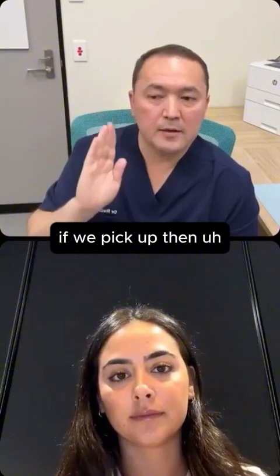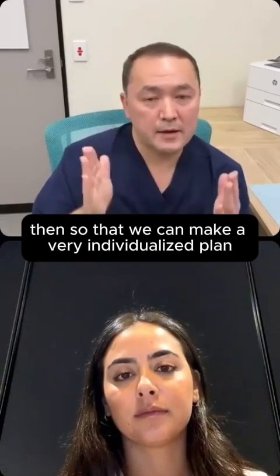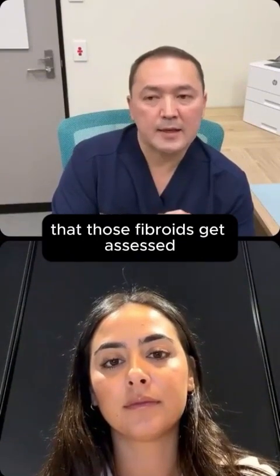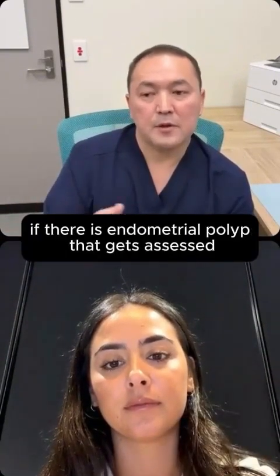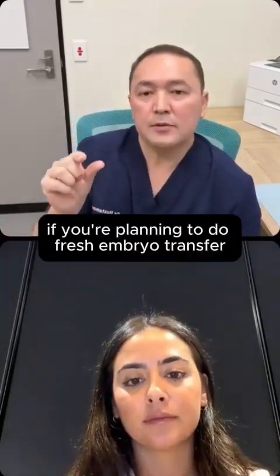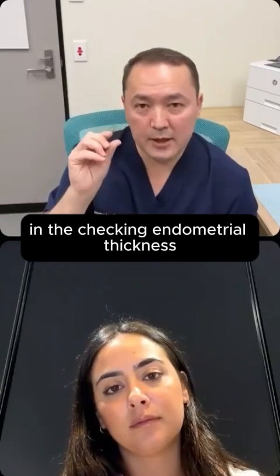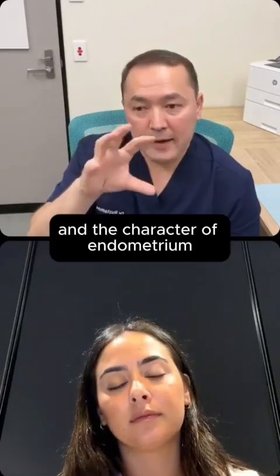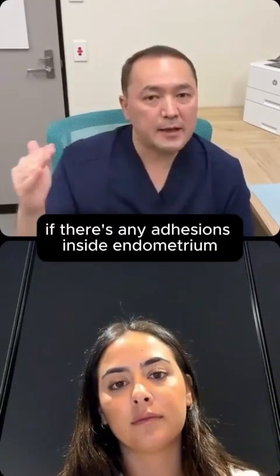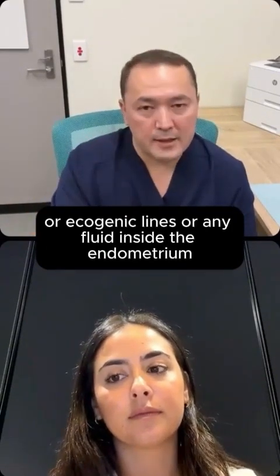If we pick it up, then usually the fertility specialist gets notified so that we can make a very individualized plan. Also, if there are any uterine fibroids, those fibroids get assessed, and if there is an endometrial polyp, that gets assessed. And most importantly, especially if you're planning to do a fresh embryo transfer, we want to check the endometrium, by checking endometrial thickness and the character of the endometrium. For example, to rule out Asherman syndrome, we need to check if there are any adhesions inside the endometrium, or echogenic lines, or any fluid inside the endometrium.